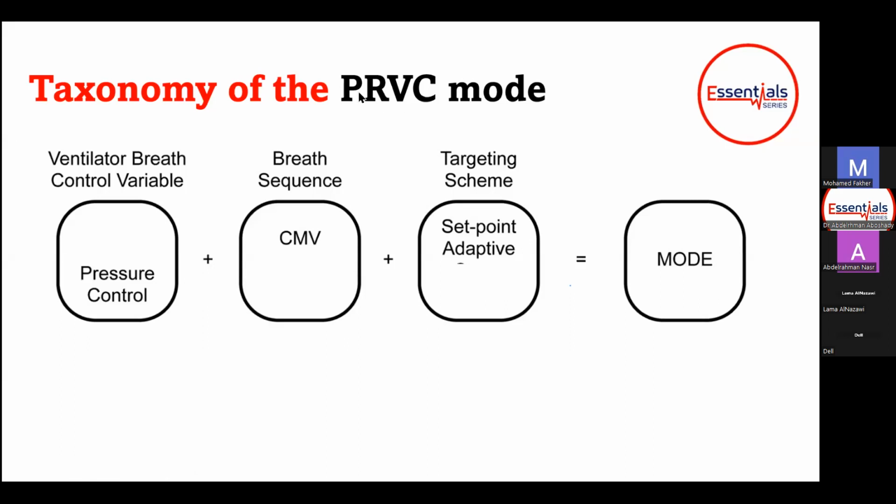That's a very good question, Dr. Ahmed Faid. We are going to discuss the difference between PRVC and AutoFlow now. Okay.